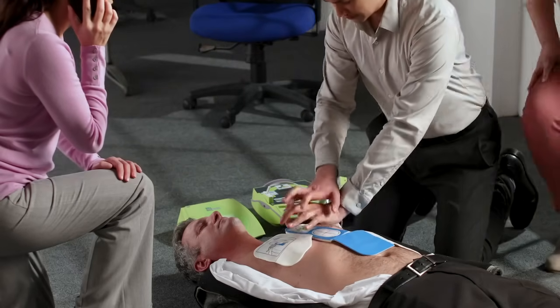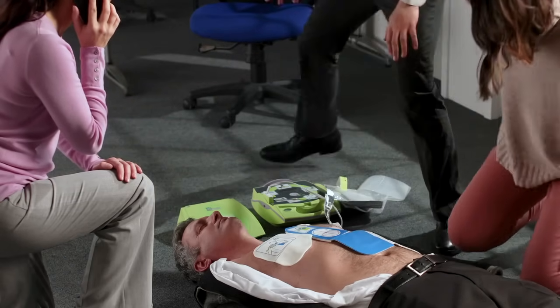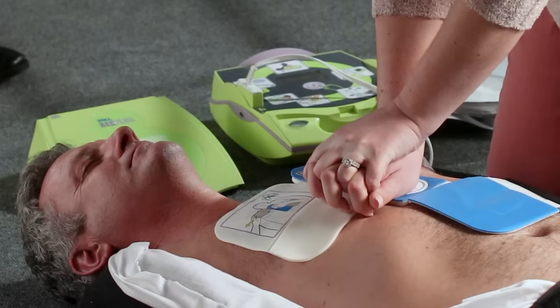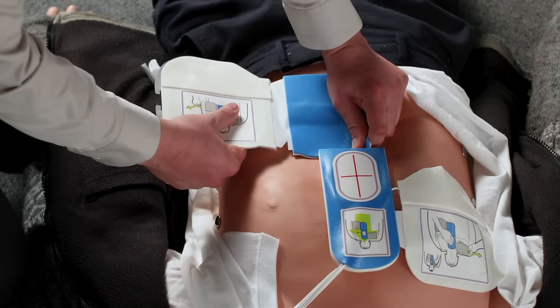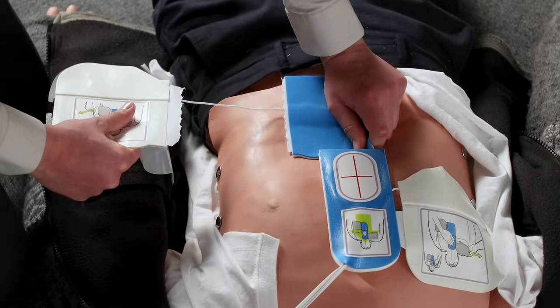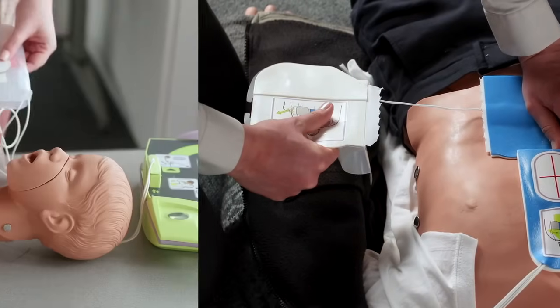Rescuers can tire when performing CPR. Guidelines recommend that when possible, rescuers take turns performing CPR to help maintain CPR quality. CPR-D pads should be used on victims over 8 years of age or 55 pounds. CPR-D pads can accommodate larger victims by separating the side pad at the slit as shown.